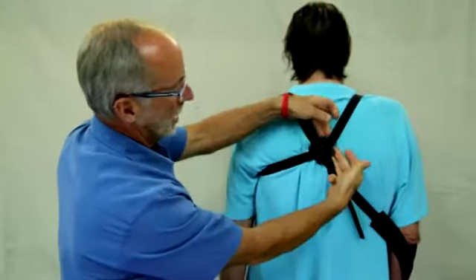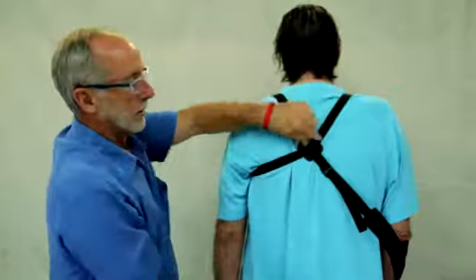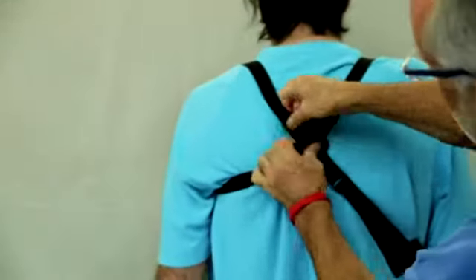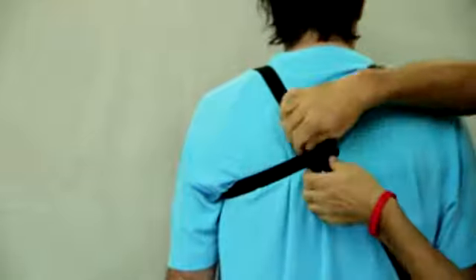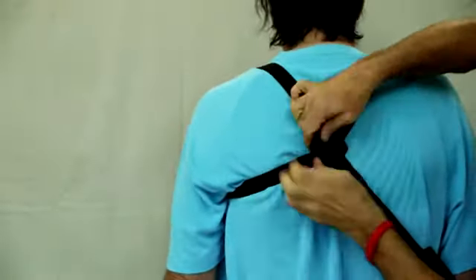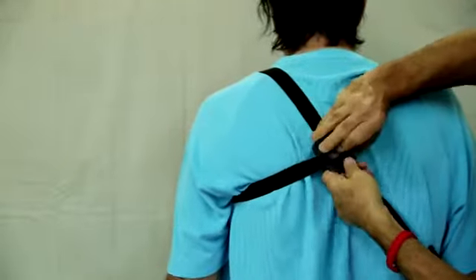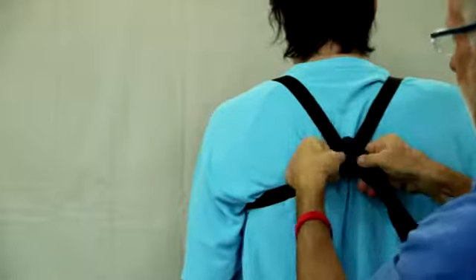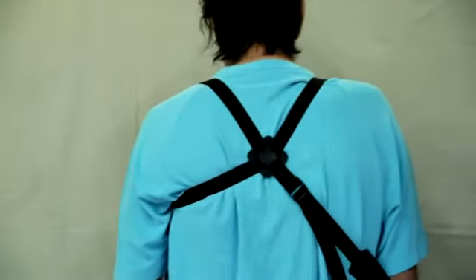To lock the four-tab, it's very simple. You just thread the webbing through the four tabs of this buckle. That's two, three, and four. And there we're locked in place.